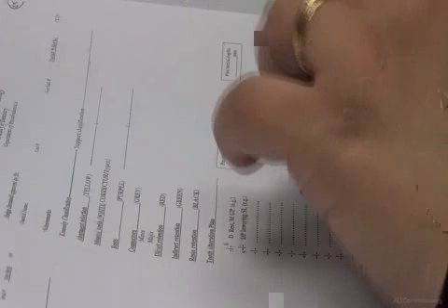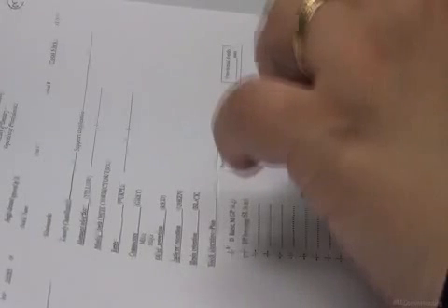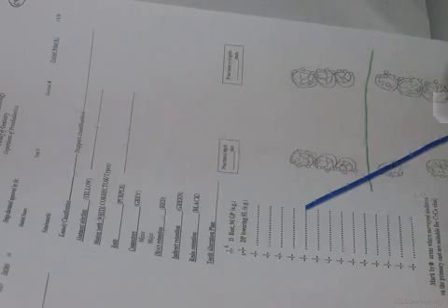Go here. In this case, do I have quadrilateral support? No, I have to add components for indirect retention. This is a tripod design, meaning I have a rest here, a rest here, and a rest here. So this is my principal fulcrum line, and this is the indirect retainer. But do I need to add for indirect retention? No, I added for another reason, which is cross arch stabilization. It's not for indirect retention.